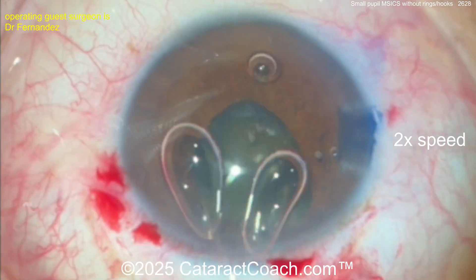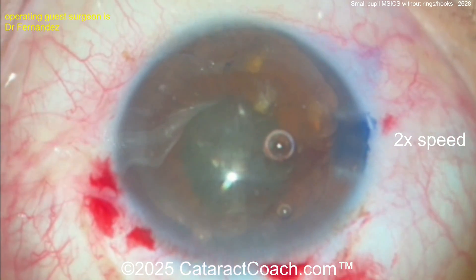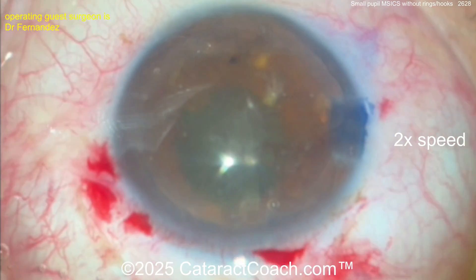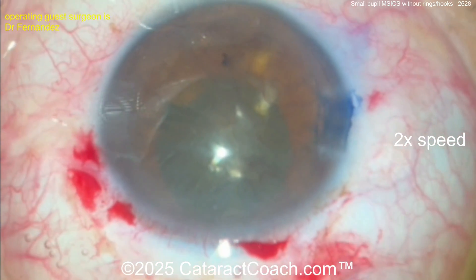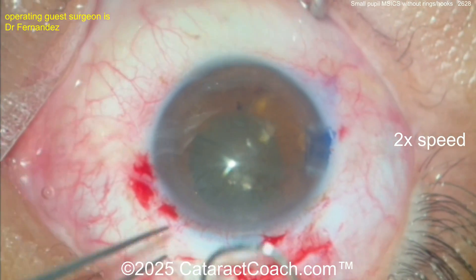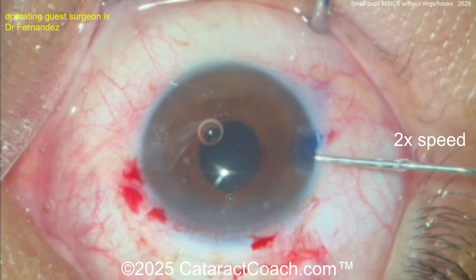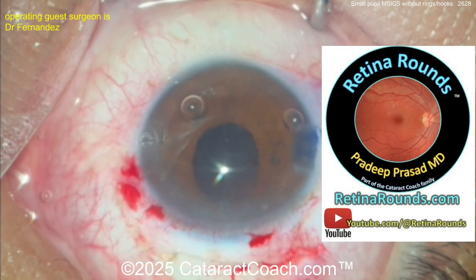There it is — and you also ideally want it on top of the capsule and then on top of the iris. Ideally the whole lens is in the AC. Now you can see it's partly in the AC — that's probably enough to put the lens loop underneath it. There you go, the whole lens is in the AC, which makes it a lot easier. More viscoelastic behind it to protect the bag and viscoelastic in front of it to protect the corneal endothelium. Now put the lens loop in and gently pull it out — don't scrape the endothelium. That's a nicely done case.